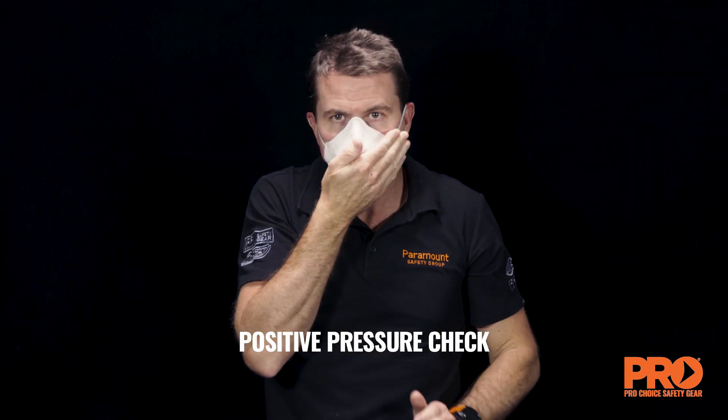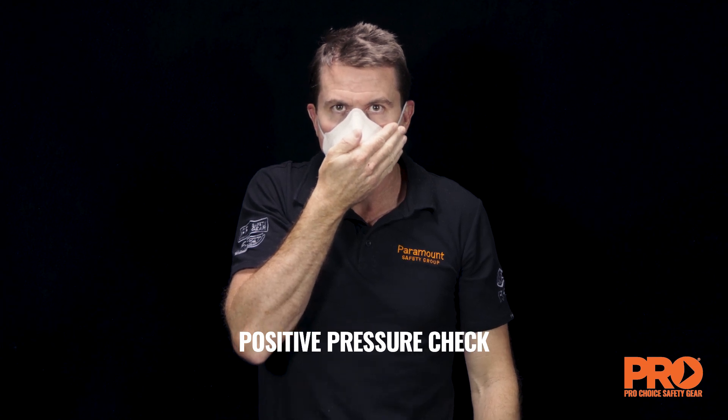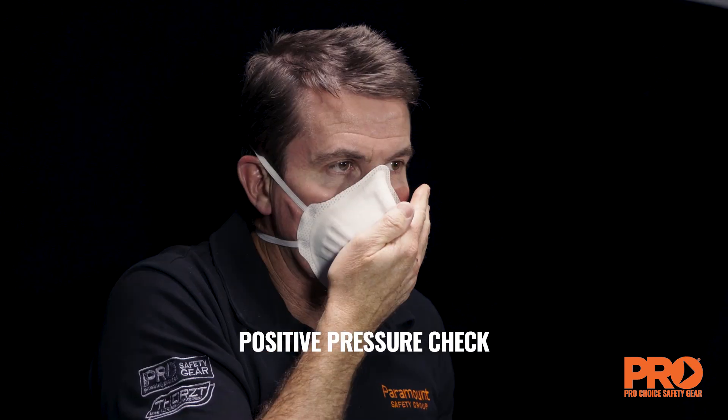The positive pressure check involves covering the exhalation valve and gently exhaling. If you feel warm air escaping around the mask, an adequate seal has not been achieved. Adjust and repeat until an adequate seal is achieved.